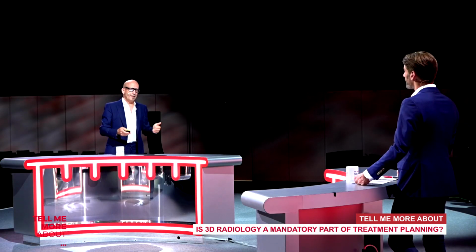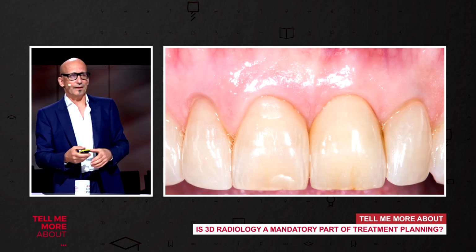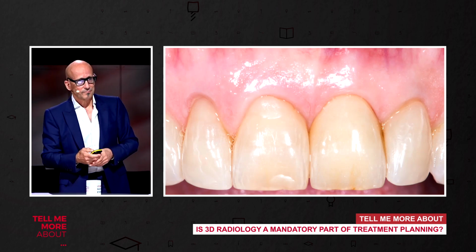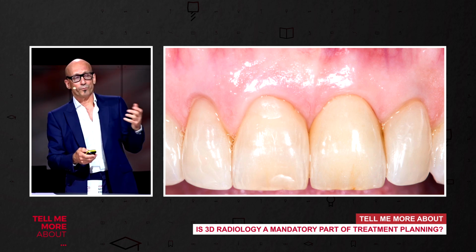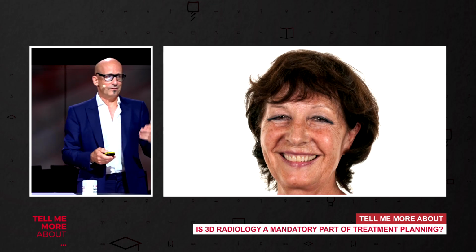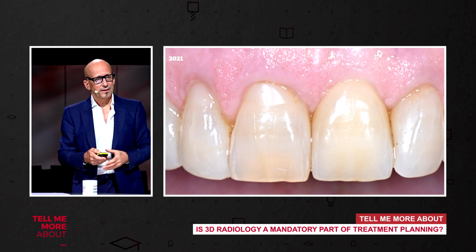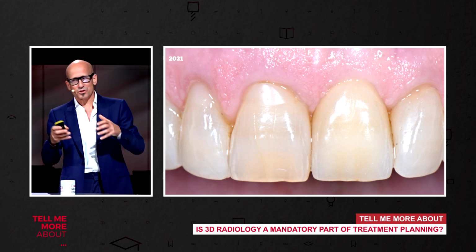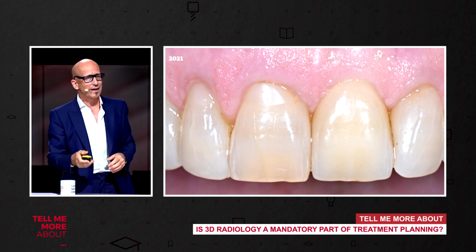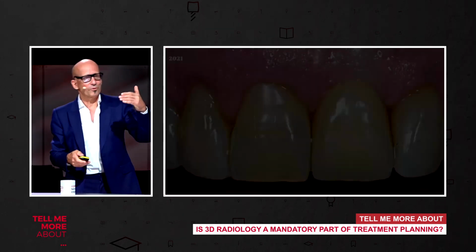And yes, in the aesthetic zone, placing an implant into an extraction socket, here we did the same-time reconstruction. Then you end up with great results, not only short term. This, for instance, is a case from 2014. And when we look at the patient 7 years later, it looks the same, completely stable, because we planned the case perfectly. We placed the implant in the right position, and we knew how this site looked like once we extracted the tooth.